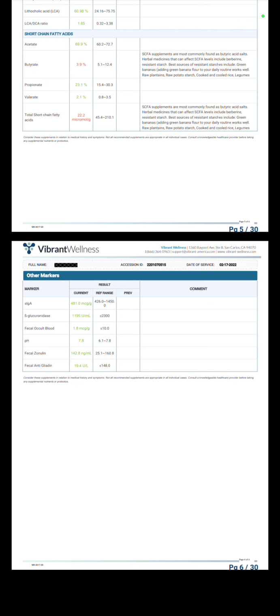And so they're more vulnerable to more advanced diseases or infections just because their immune system is not on its A game. And you'll see there the pH that I was talking about. Hers is 7.8, and that's a really basic stomach environment. We want to make sure that's much more acidic, like 6.2. And that will really be the driver of pancreatic enzyme production. So we know that we can start there too.